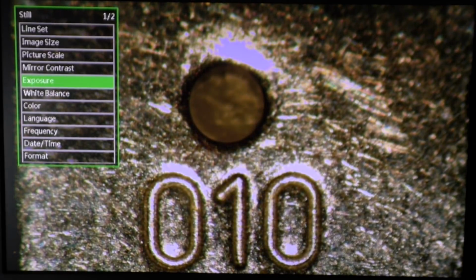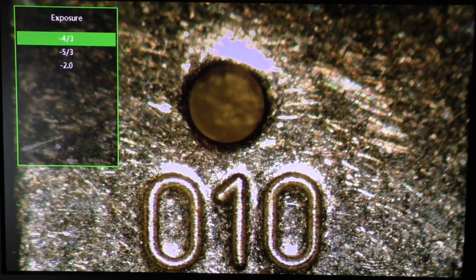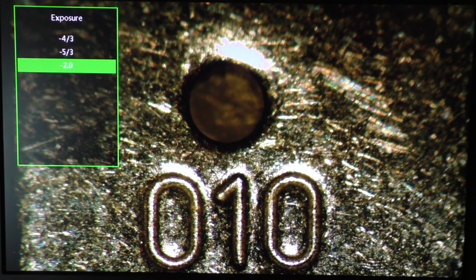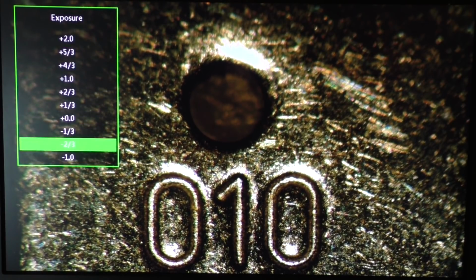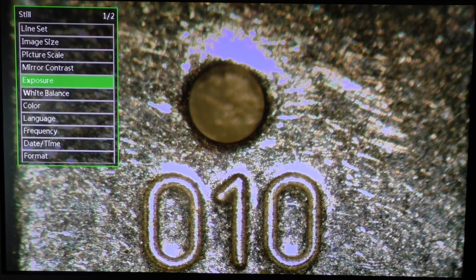Let's see if we can do that a little bit better. Yeah, a little bit. How much? I find the numbers are funny. -5/3 or -2, I don't know. Maybe that's the right way to number this exposure factor, so that's what I like.